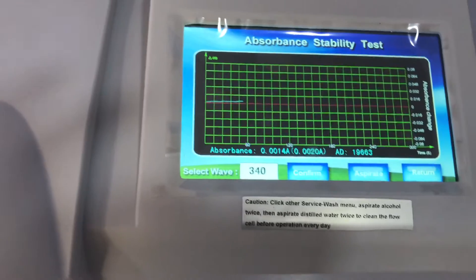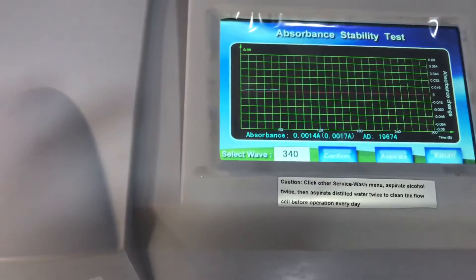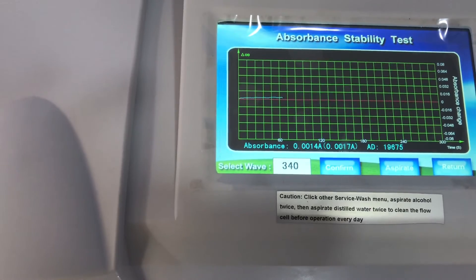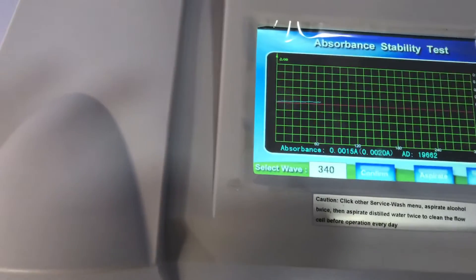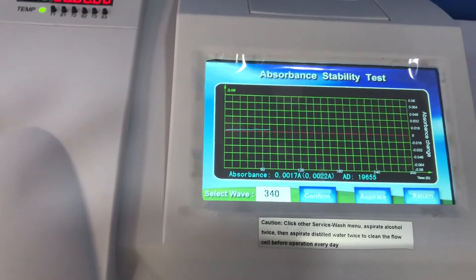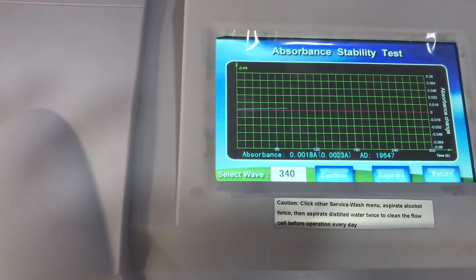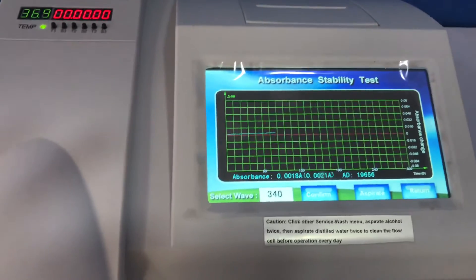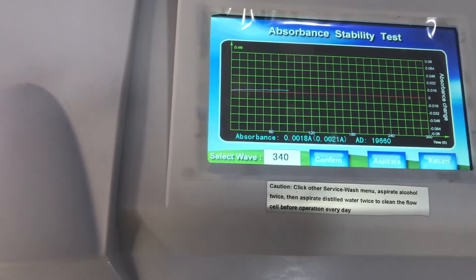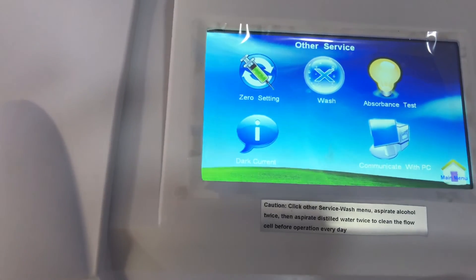We'll end this video here so it doesn't get too long. When I did my zero setting one wavelength was high because I didn't allow the machine to fully incubate, so take note of these technicalities to ensure your machine gives you quality results. We'll continue with part two. Thank you.